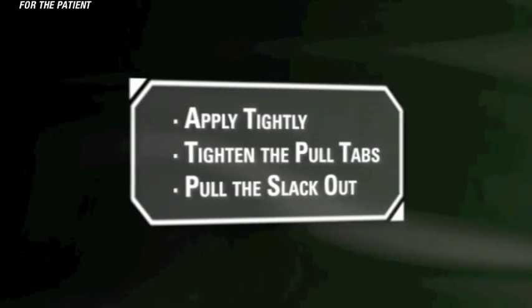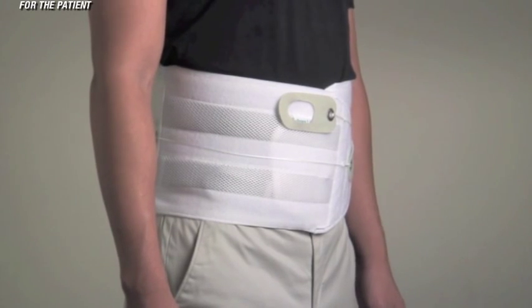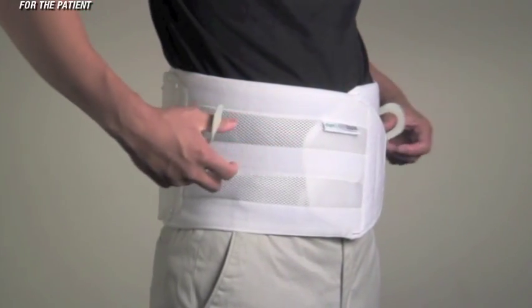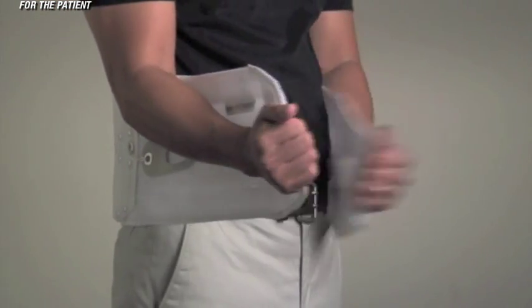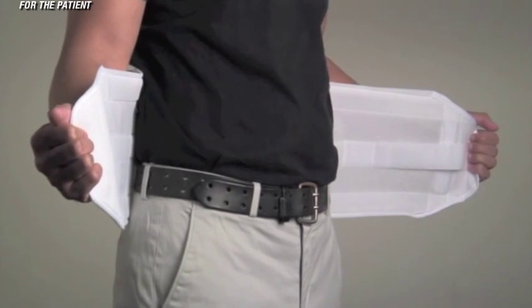Third, when removing, pull out all slack. When you remove the brace, reposition the pull tabs towards the back of the Quickdraw, and as you disconnect the ends of the brace, make sure to pull all of the slack out. This will ensure that the Quickdraw is ready to work when you next apply it.